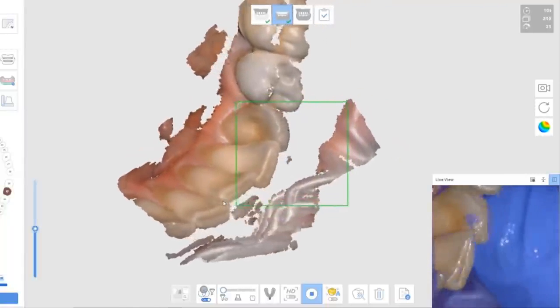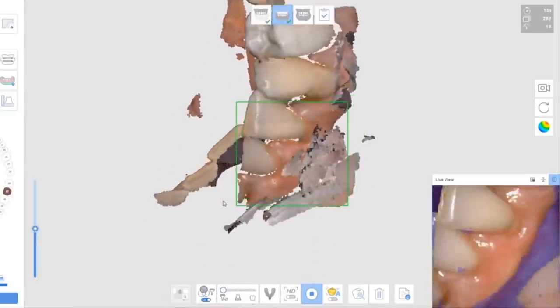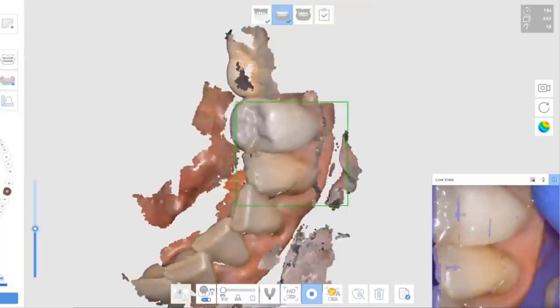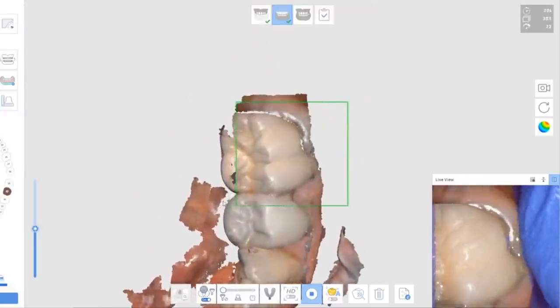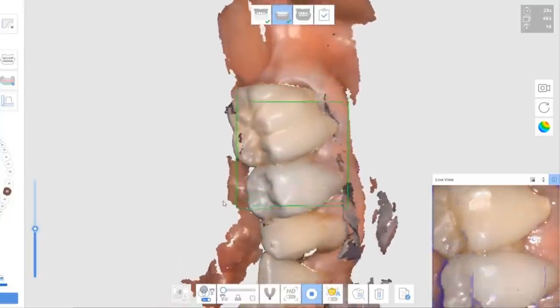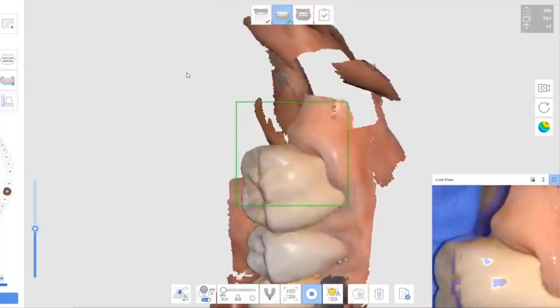So the combination of the short focal distance from the tip of the camera, but more importantly the blue color of my gloves, without any suction, without any assist, without any air blowing on top of the teeth, although the camera itself does project air onto the surface, it keeps the mirror from fogging, I can fill in and pick up all this data.